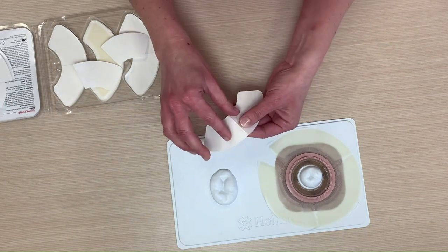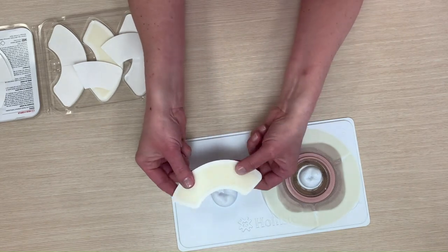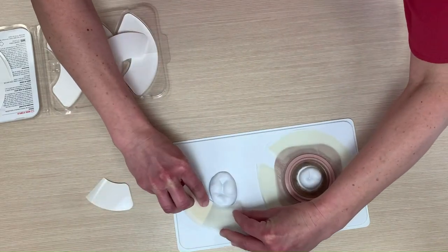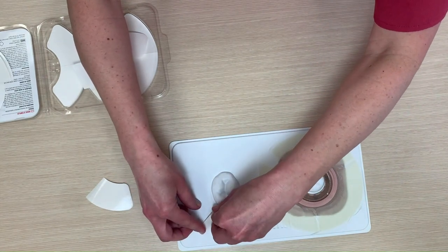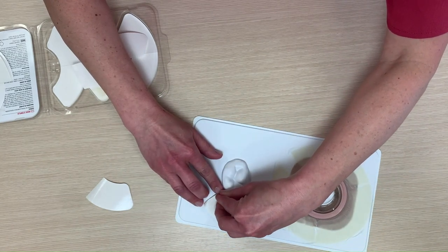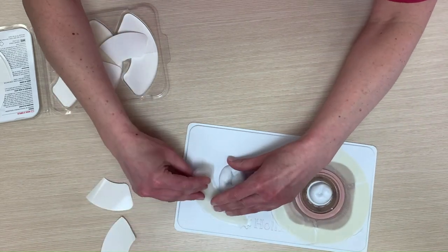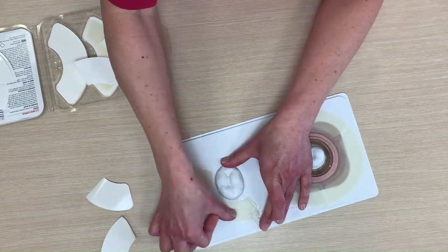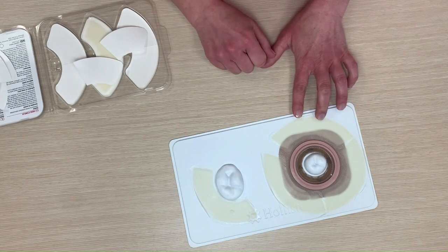One interesting tip we've gotten from customers is if you have some redness and raw skin around one side of your stoma, you can use these as basically a wound treatment underneath before you apply your new barrier. These are very sticky but won't leave a residue. Because it's a hydrocolloid — breathable and waterproof — you're getting a lot of protection for that raw skin. Then when it heals, you won't need that as part of your routine, but you've got that added layer of protection.